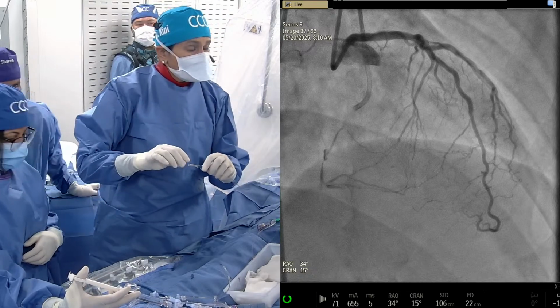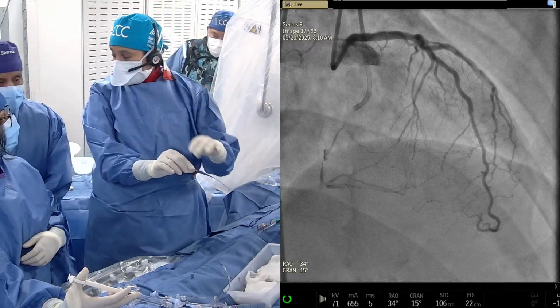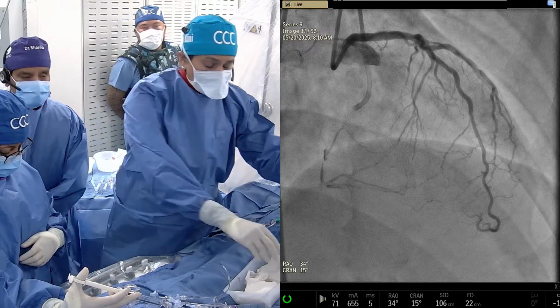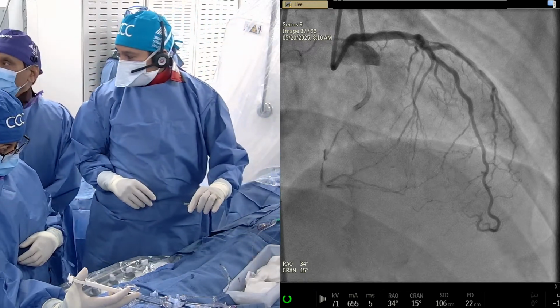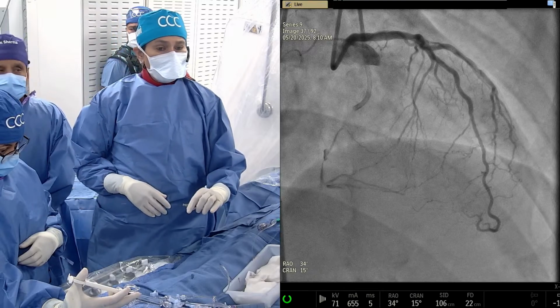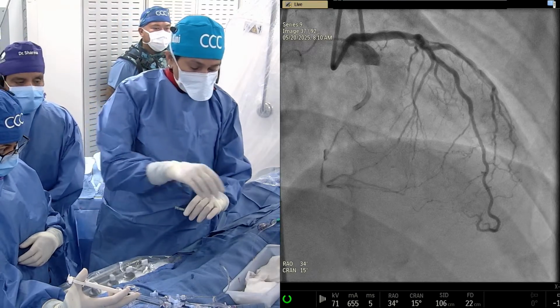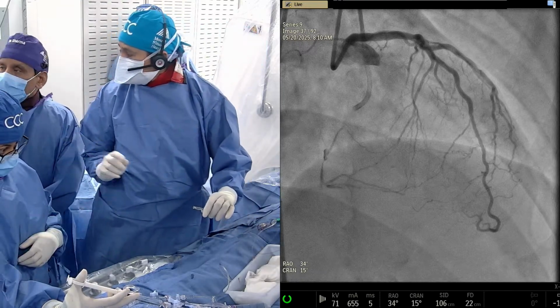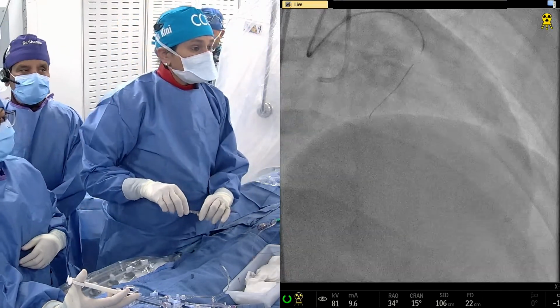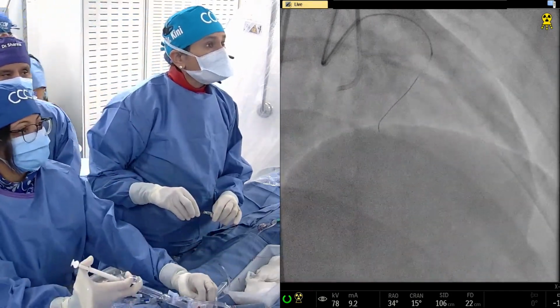And what wire, what catheter? This is a regular Fielder. I think we went through this a few months back with all the various wires that we have. We can show the long Corsair? Yes, this is a Corsair 150, and Andrew can show some of those. Last time we had a discussion about why we should use SUO. We can show those slides.